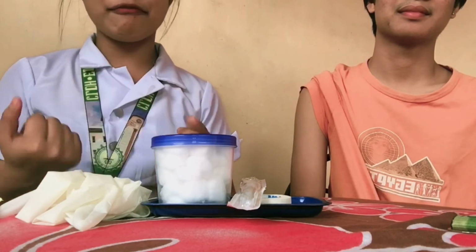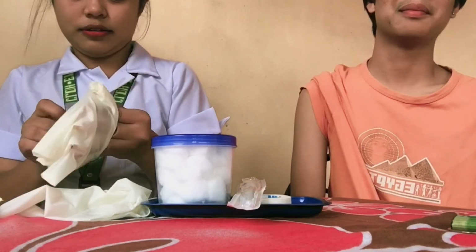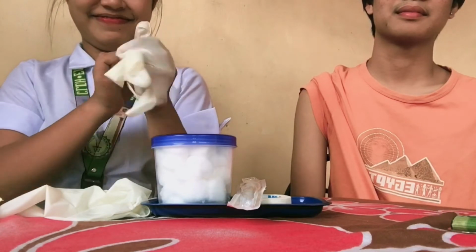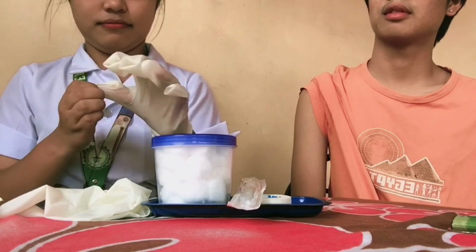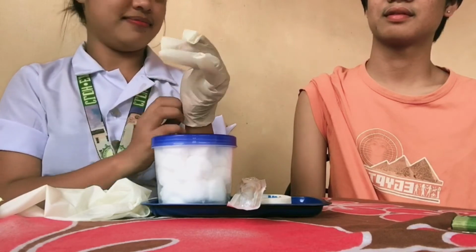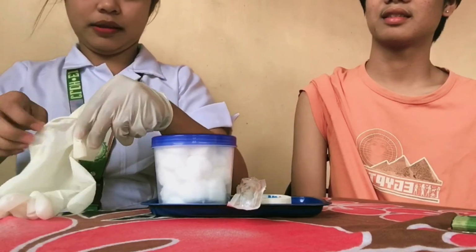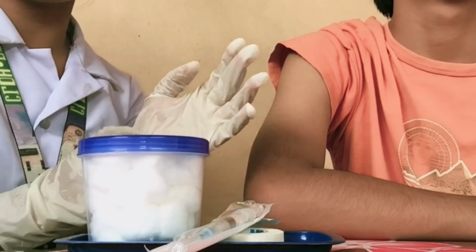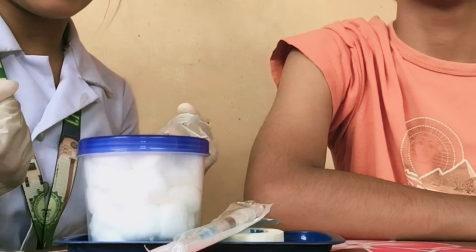Next, I have to apply clean gloves for safety. Now, after wearing clean gloves, we need to select the site where we inject the medication.